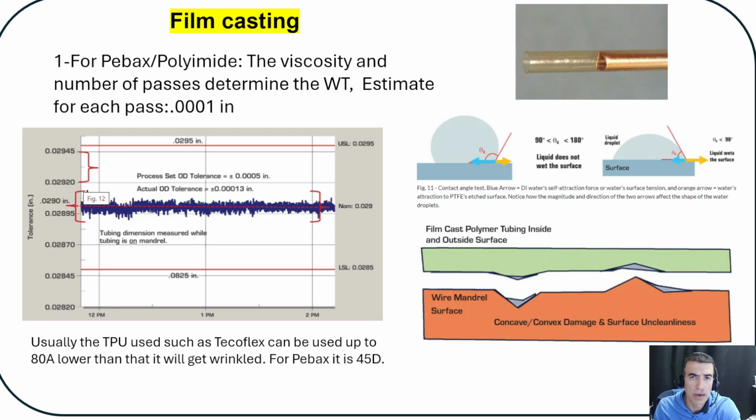And you have different applications. For example, you have very soft material for neurovascular applications, catheters, or you can go to a little bit harder material. And one very important thing about PTFE is that it is neutral, and it would not basically get wet. So usually we measure a contact angle, like you put a drop of water and measure the angle that it makes with the surface, and it would show how much contact angle or hydrophobic properties you have on PTFE.